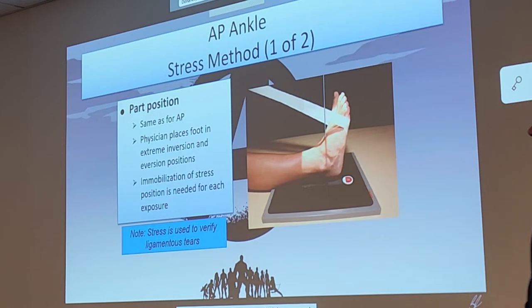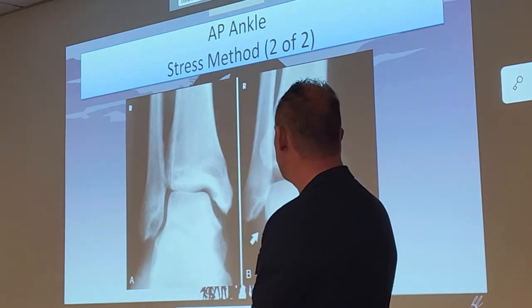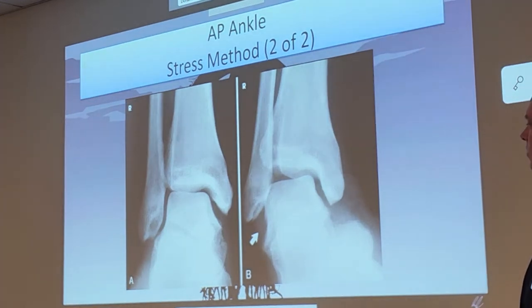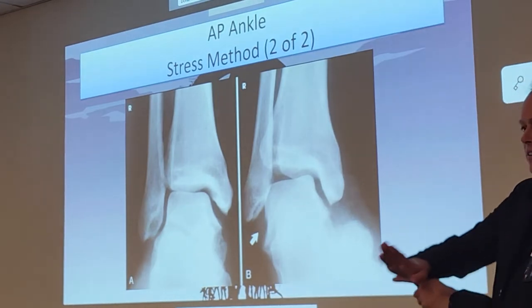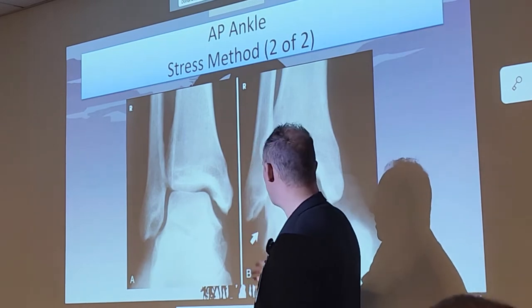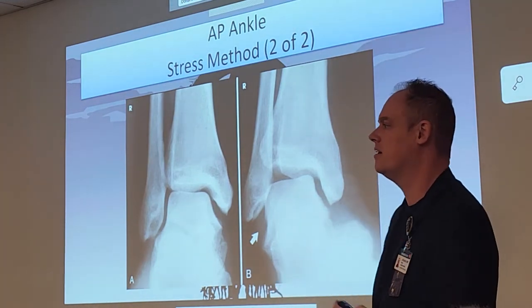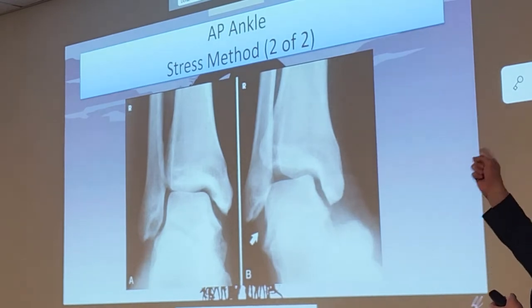Here's an example of eversion and inversion — can you tell which is which? The left image is eversion because the foot is going lateral; the right would be inversion. They're mainly looking at the areas where the ligament attachments are, to see how flexible it is and whether there are tears. We cannot see ligaments and tendons on x-rays — that requires MRI.